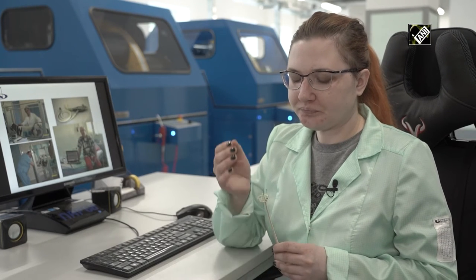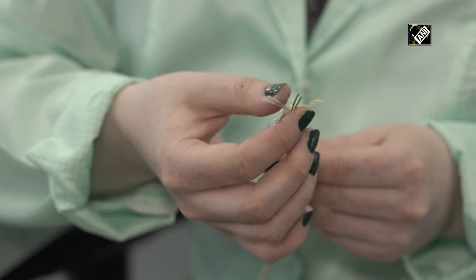This cable is used in a universal complex for mechanical support of the function of the right and left ventricle. Inside there is a central element, six conductive wires are twisted around it to form a core. Then it goes to the braiding machine.